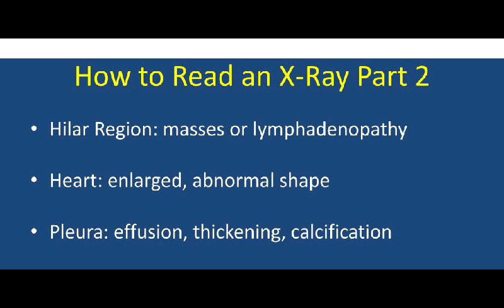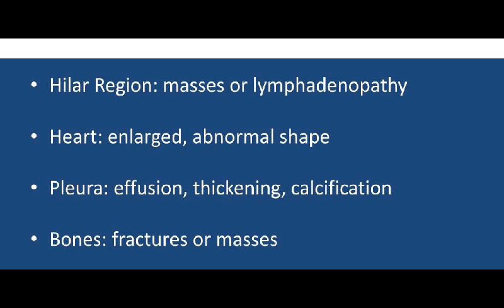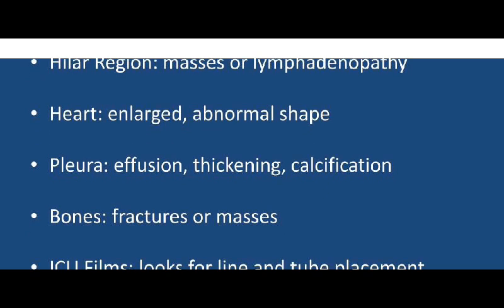Yes. Now we look for an enlarged heart. Remember, I told you that when the heart is enlarged, it can indicate many things. Most of the time, it can be cardiomegaly. Yet, when the heart is overworked, cardiac failure can lead to an enlarged heart. Now, we have the pleura. In the pleura, you check for effusion, thickening and calcification. That is in the pleura of the lungs. Effusion is the accumulation of fluid in the lower base of the lungs, then thickening or calcification.